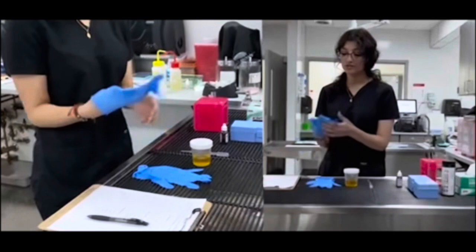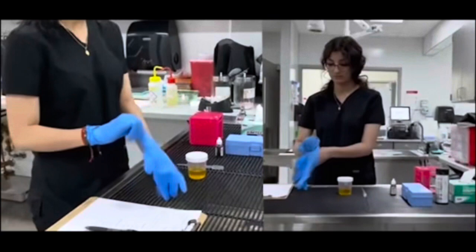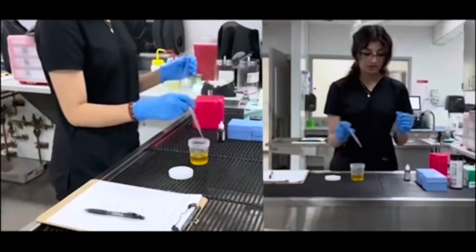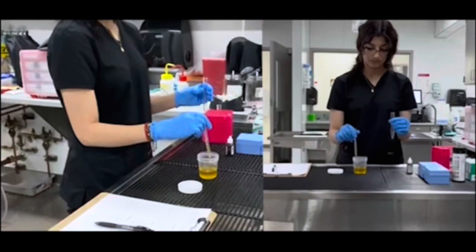Your next step after that is to put your gloves on and get ready to transfer the urine over into the clear vial. Now you want to open up your urine sample and grab your tube. You want to fill it up to about the first line with the urine — right there should be perfect. Then you want to set that back and close up your urine sample so it doesn't get contaminated.